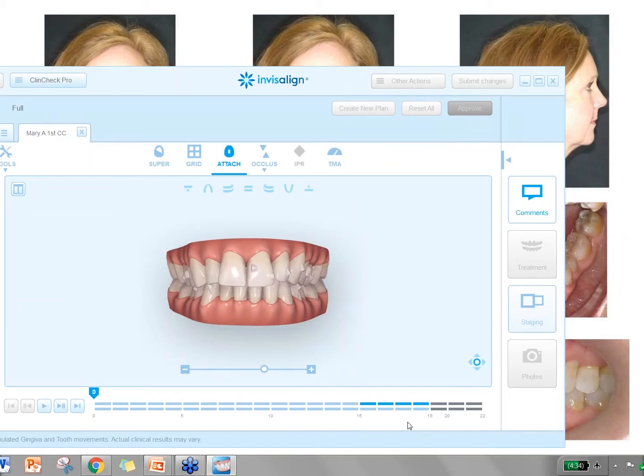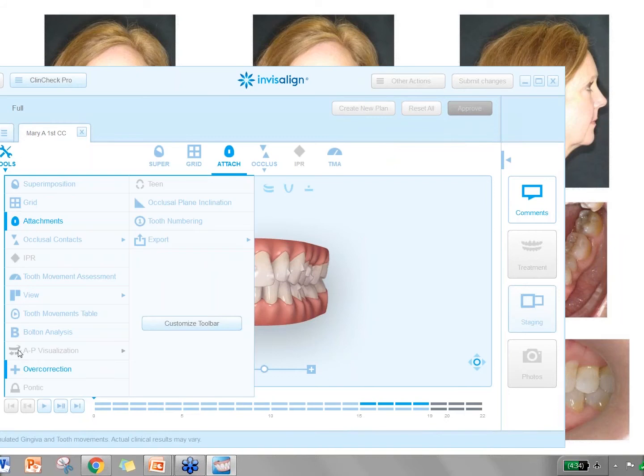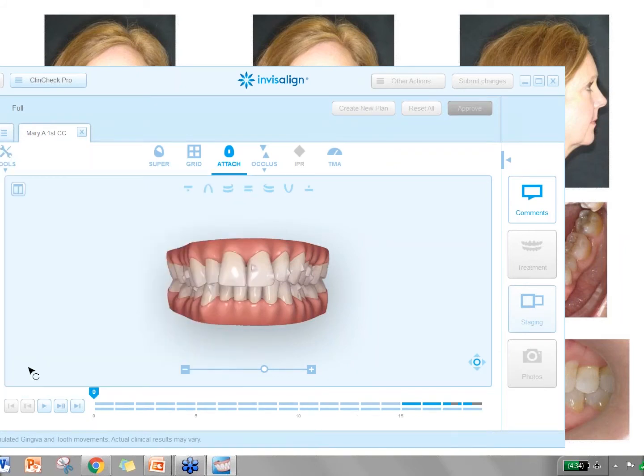And I've got 19 aligners for her. Again, overcorrection, which I use often, or ask for often, but rarely use. And we're going to go ahead and do that osteo-perforation on the top and the bottom, only in the anterior. I'm going to get good expansion in the posterior, so I didn't have to really worry about that. You can again see the power ridges, which are automatically placed, so I can get some good root torque.